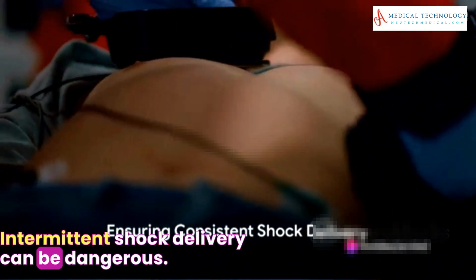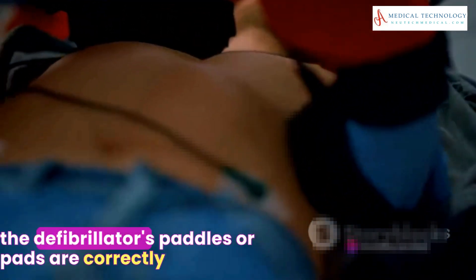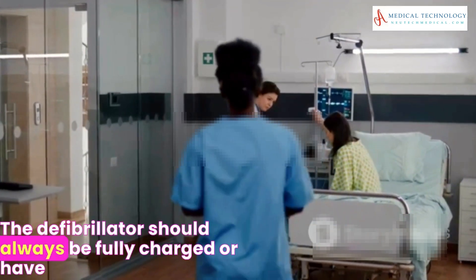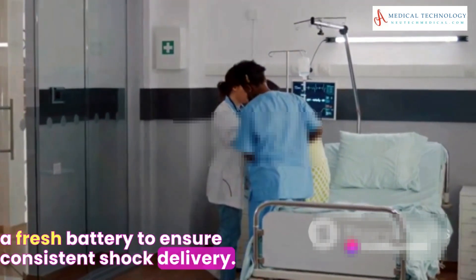Intermittent shock delivery can be dangerous. Inspect the electrode pads and cables, and ensure the defibrillator's paddles or pads are correctly applied to the patient's chest. The defibrillator should always be fully charged or have a fresh battery to ensure consistent shock delivery.